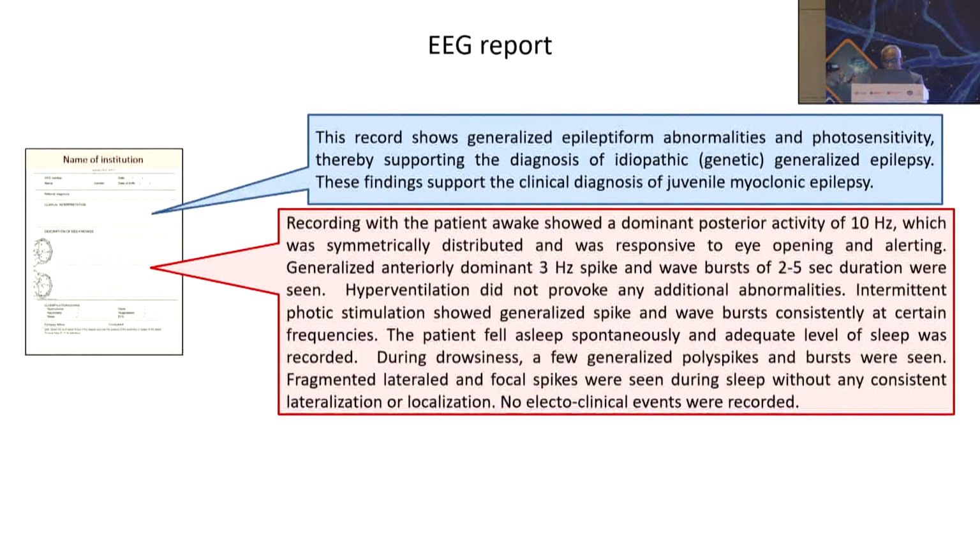When I underwent training, and other fellows from the rest of the world at Mayo Clinic, when they undergo training, we used to go through the reports which had been written by Dr. Klass or Dr. Westmoreland and take a printout of that, and whenever we see a similar patient, we frame the report in such a way. That is how we learned it. I hope you will also do that, and then the reporting will be done in that fashion.